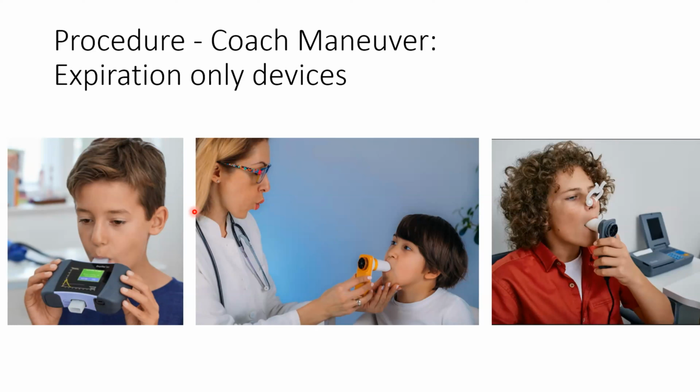And it's important that that does not take more than 2 seconds. So you have them do their normal breathing, deep breath in, put the mouthpiece in, and blast out. And only 2 seconds up there at TLC. And this is where sort of that end of test from the previous guidelines can apply, because they're not going to be taking that forced inspiratory vital capacity back in.